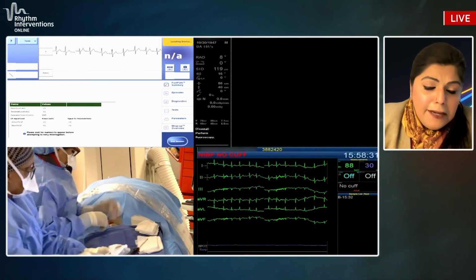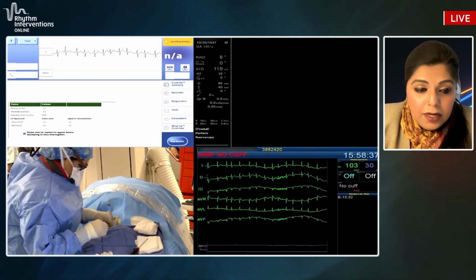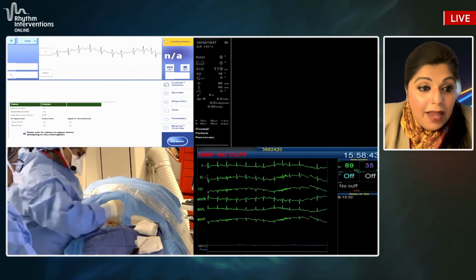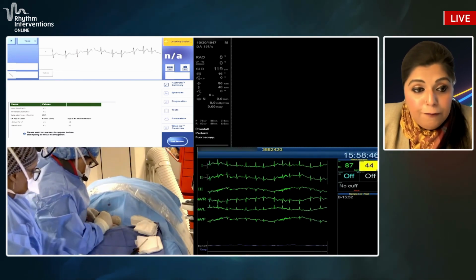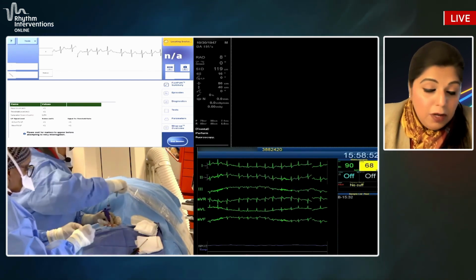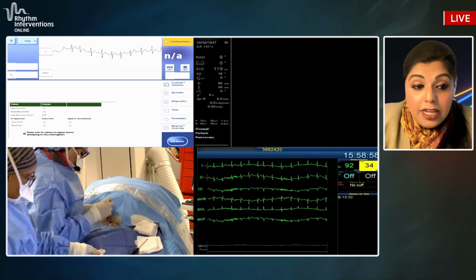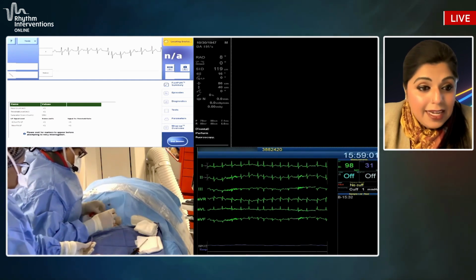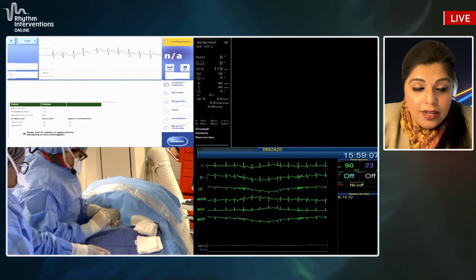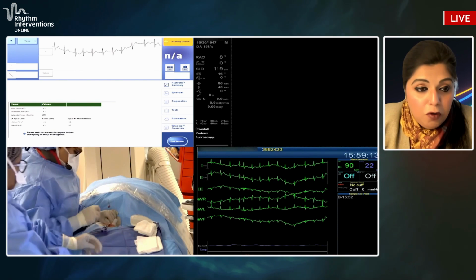He's an 84-year-old gentleman who has been known to our service for a very long time, has had chronic long-standing, now permanent AF, has had multiple GI bleeds in the past, and had a Watchman Flex device implanted for stroke prevention because he could not tolerate oral anticoagulation. He was on AV nodal blocking agents, and recently had a couple episodes of syncope and a monitor showing significant bradycardia. He is currently off of his AV nodal blockers because of a significant tachy-brady syndrome. And to me, this is an ideal patient who has a normal ejection fraction, has intermittent bradycardia with permanent AF, that is a candidate for a leadless device.